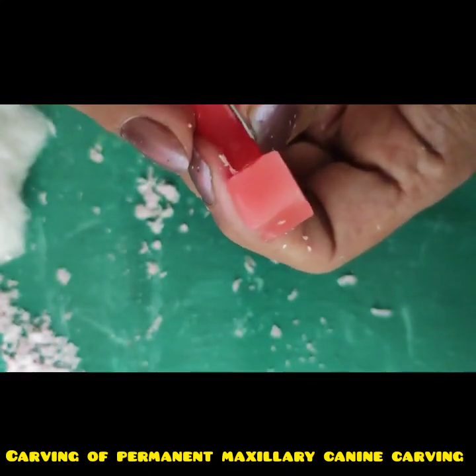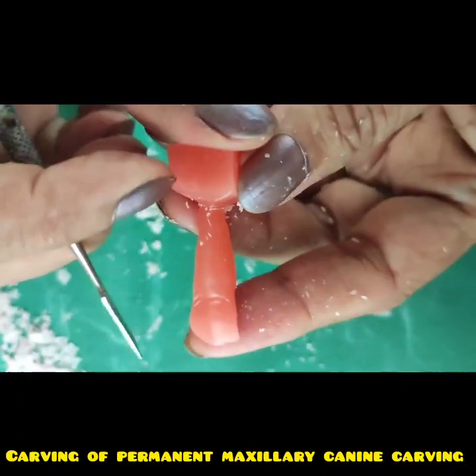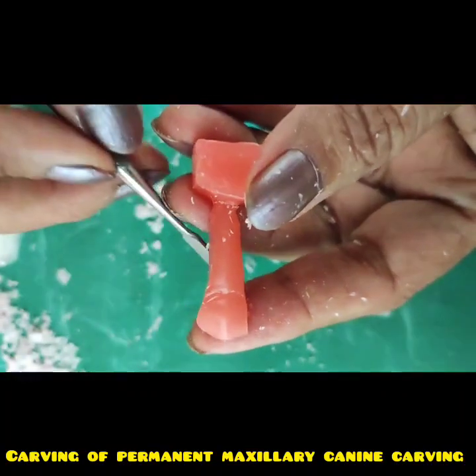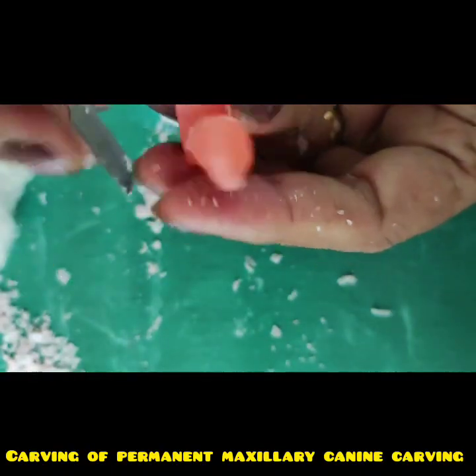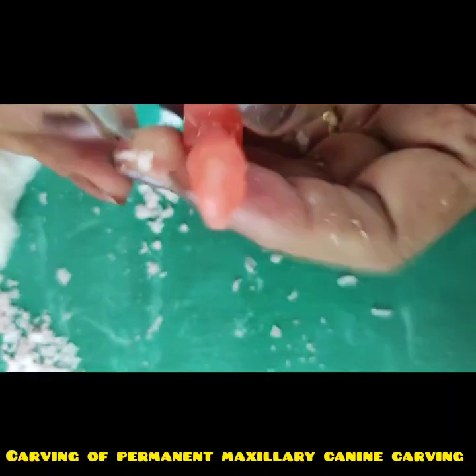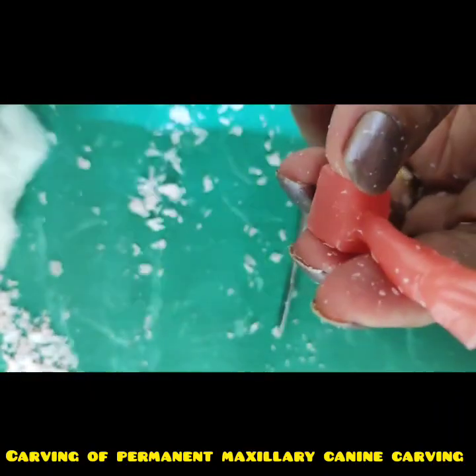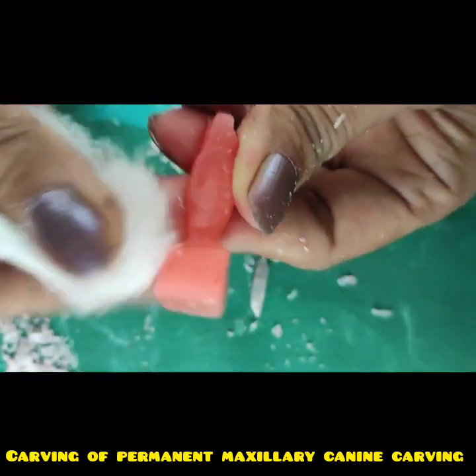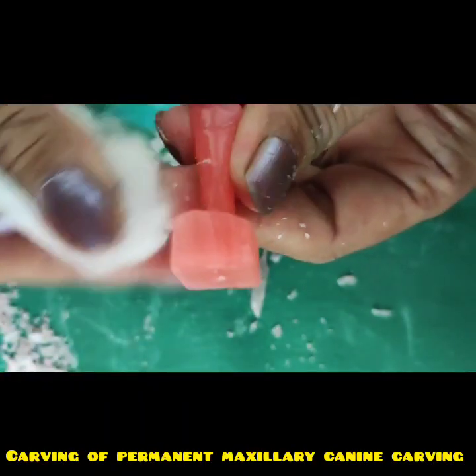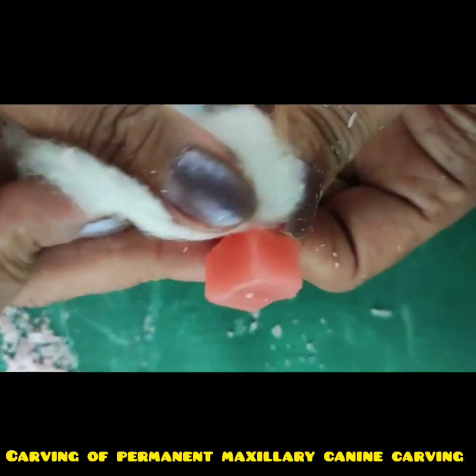because only a single block will be given to you like this. Can you see? Now this is my distal surface, and now the root tip is shifted towards the distal. So that is why I keep a little extra wax for rectification. Okay, so if you keep 1 mm extra wax all around, you have a good scope of changing the morphological features on your carving.